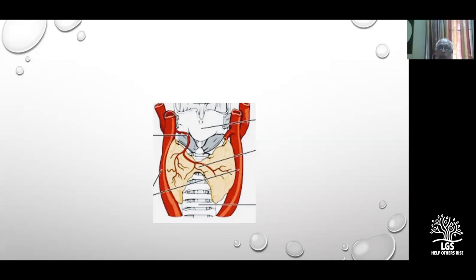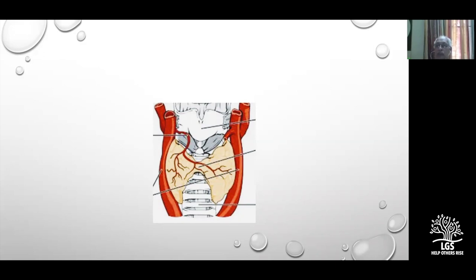Once you pick up and ligate the anterior branch, the two cut ends move apart. The superior pole is tethered to the gland by this anterior branch — once you divide it, that tethering disappears and dissection of the superior pole becomes much easier. Ask your assistant to retract the upper pole, and you can see the trunk of the main artery entering the gland. The principle is to ligate it as close to the gland as possible. You do not need to search for and identify the external branch of the superior laryngeal nerve — if you stick to this technique, the nerve is far away and will not be damaged.